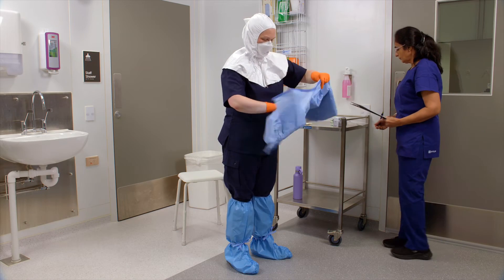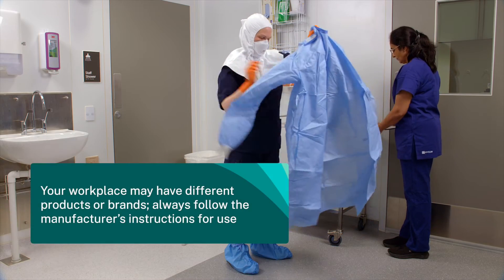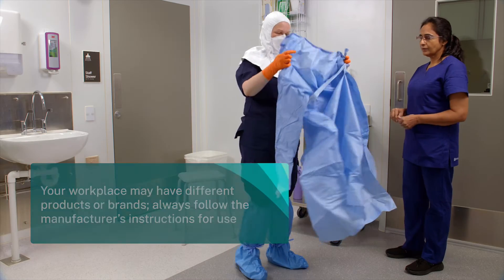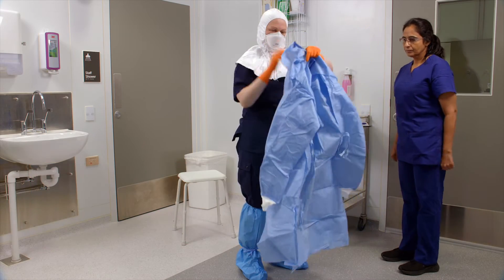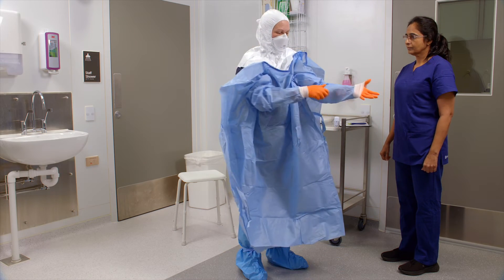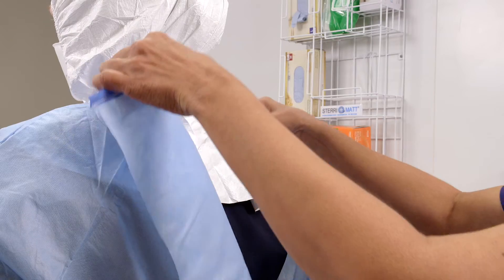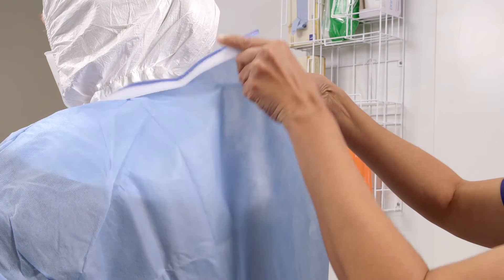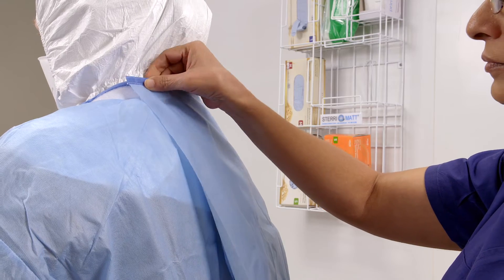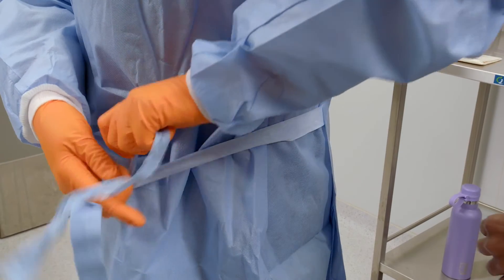Open the gown and check it for any tears or holes. Don the impervious gown. Secure the gown at the back of your neck and around your waist. Tie at the side in a bow.